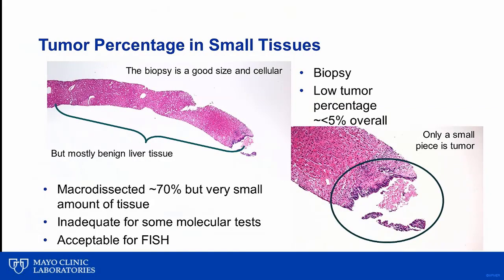With small biopsies, we frequently run into inadequate tumor percentage. The biopsy itself is actually a very good size — at least one centimeter — however, the majority of the tissue is actually benign liver with only a small area containing tumor. The overall percentage of tumor nuclei is quite low. We can try to macrodissect out an area with a much higher tumor percent, but it would be an extremely small amount of tissue, requiring many unstained sections to accumulate enough tissue for testing. So this specimen may be inadequate for some molecular techniques, but with over 100 tumor cells present, it would be acceptable for FISH.